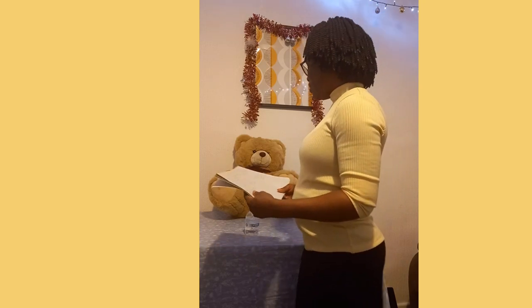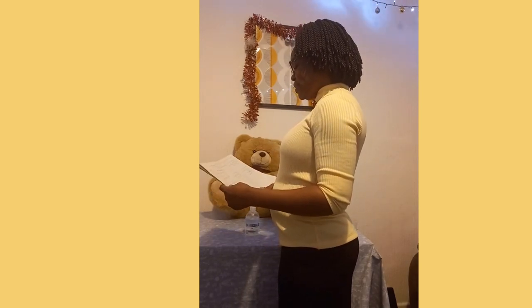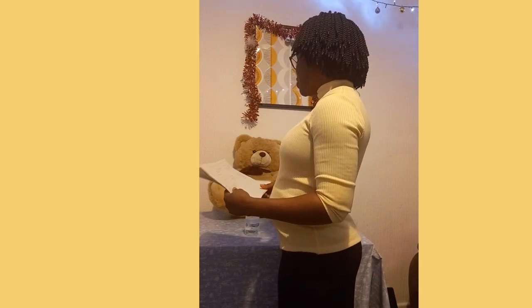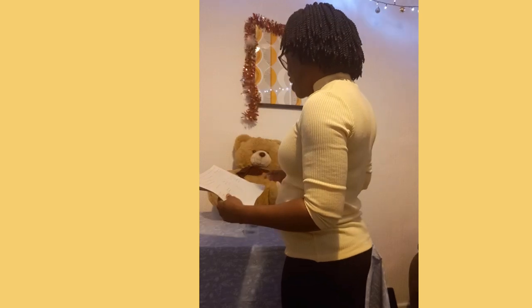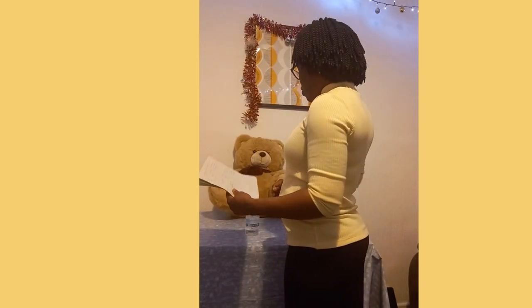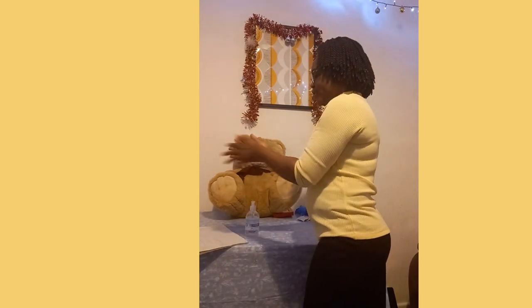We'll step aside now to go and prepare the medication. But before I go — have you had this medication before? Yes. Can you remember which site the injection was given to you through? Left arm. It was administered through your left arm. Is it okay if I make use of your right arm this time? Okay, nurse. All right, thank you.